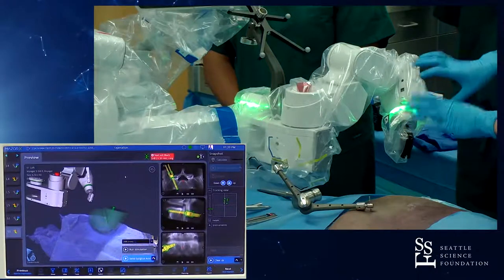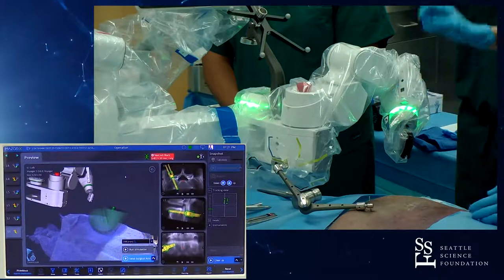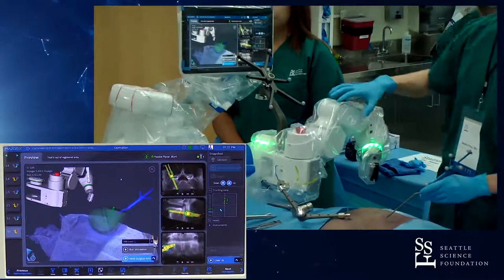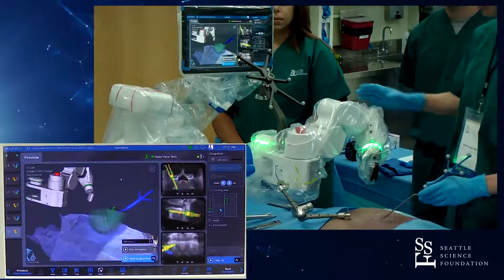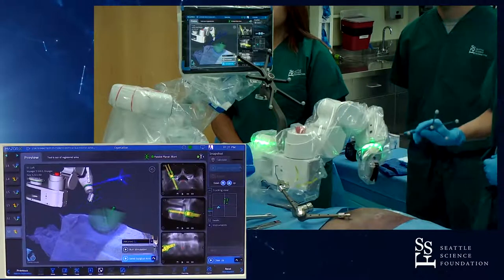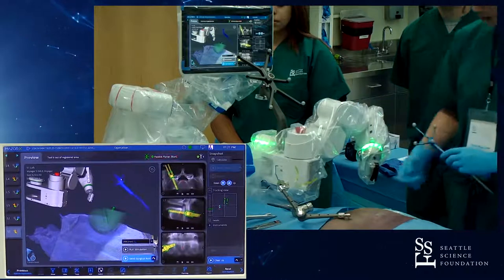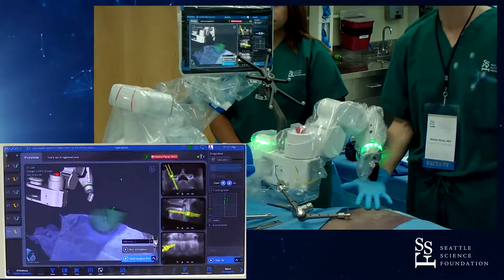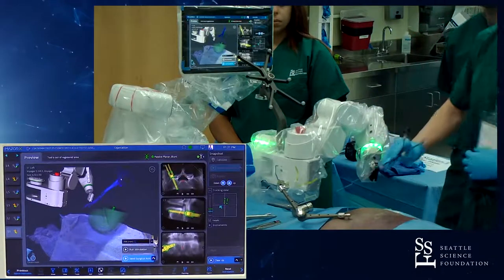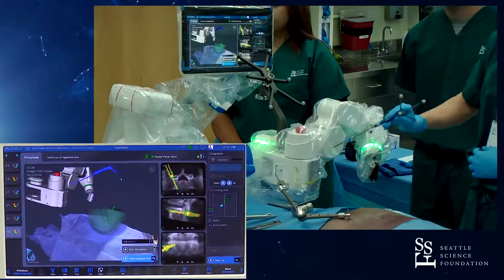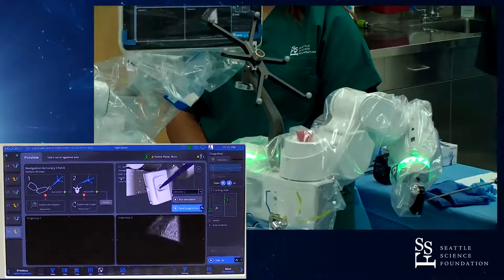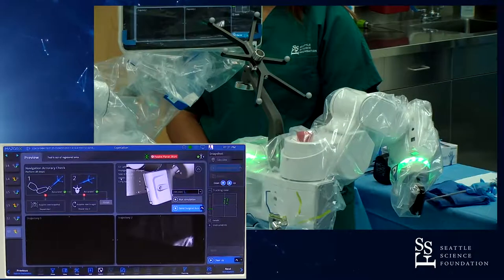Once that's done, the robotic arm is then registered to the stealth navigation. The arm itself knows its position in space throughout the six joints, and just like proprioception, it understands where it is in three-dimensional space. The stealth navigation system is now told where the arm is. Once this arm is in a set position, the arm holds something called a snapshot tracker. The stealth eyes take that picture, and so now stealth understands and can see where the arm is so that you, as a surgeon, can see this depth. There's a divot on here to confirm the accuracy, and when you put that on the divot, you can see the accurate representation of what the stealth station knows of where the arm is.